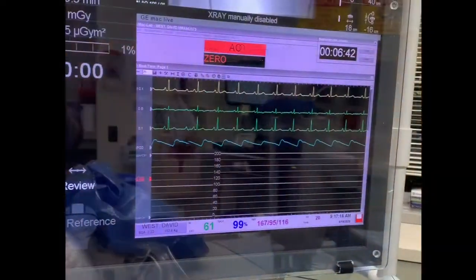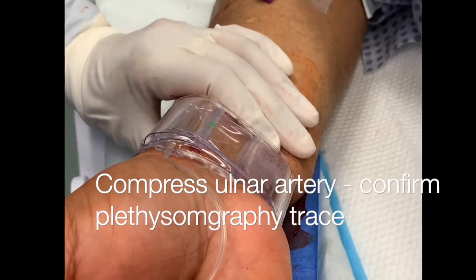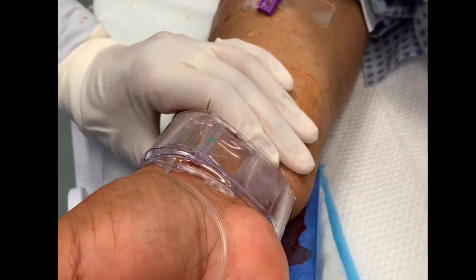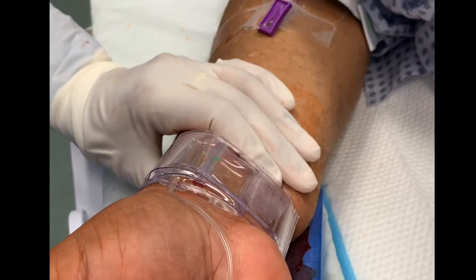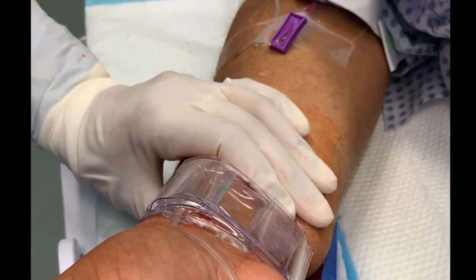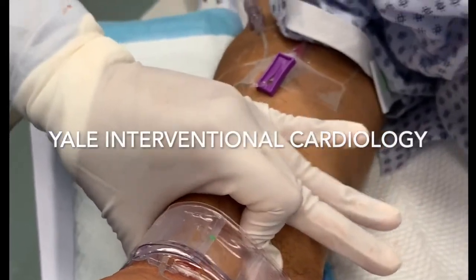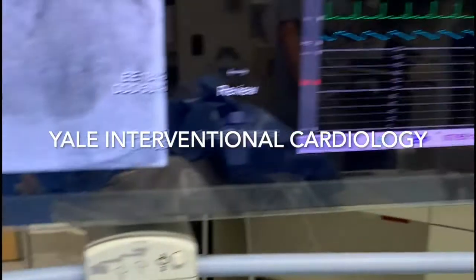Plethysmography is placed on an index finger. You can see good waveforms there. We are intentionally compressing the ulnar artery to ensure that we are still getting a good tracing on the pleth, which suggests that the radial artery is not occluded but has flow. This is the best way to ensure patent hemostasis.